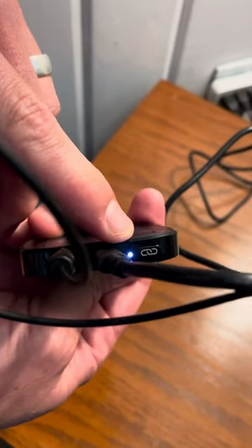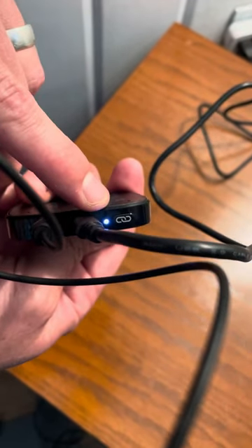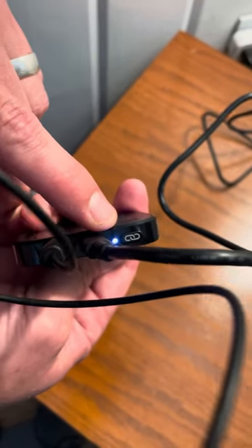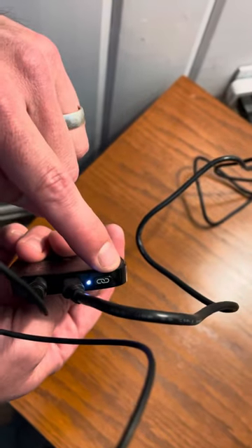I'm actually wearing a set of Phonak hearing aids now, and what happened is I heard a confirmation beep indicating that the hearing aids are connected. They should do that automatically. If it doesn't do it automatically, you will need to press this connect button briefly.